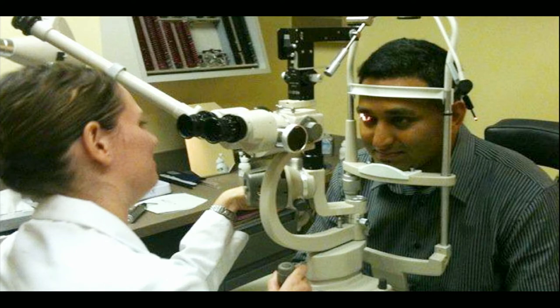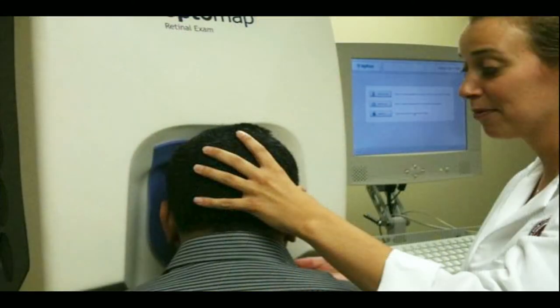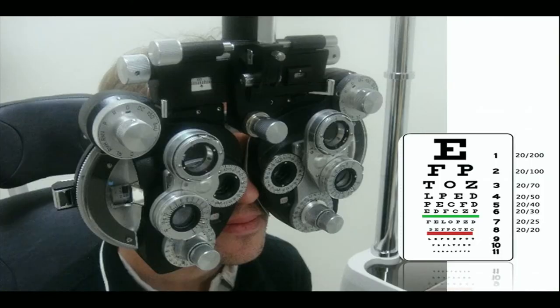for getting a cataract test? We're using these old devices to get retinal exams. We're using these really expensive devices, but check out the user interface. The nurse has to shove my head so that my eye is aligned. I mean, I can use some complicated instruments, and look through a phoropter to get eyeglasses. So we're making some progress in looking into our eyes.